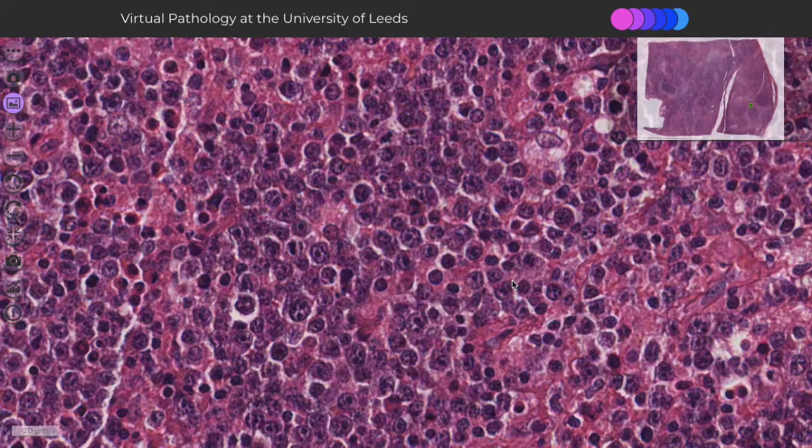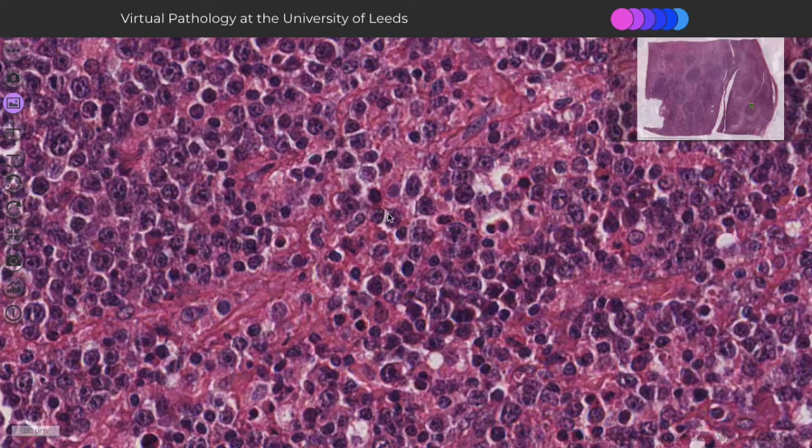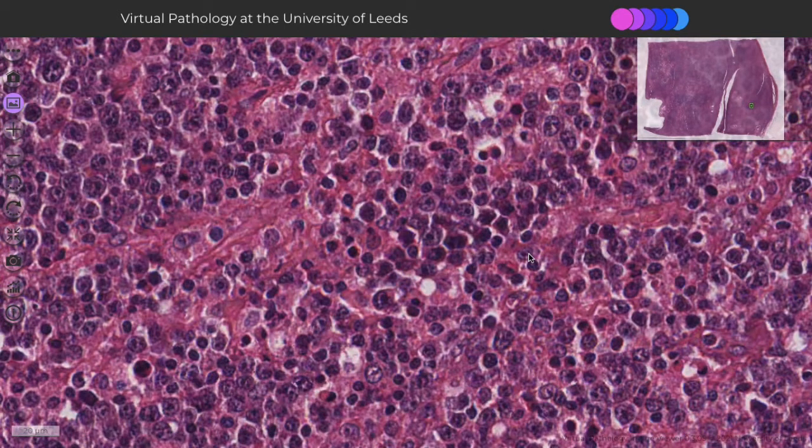Important characteristics that can help you in distinguishing a lymphoma from certain germ cell tumors include whether or not there is presence of fibrous septa with lymphocytic infiltrate, which is characteristic of seminoma. Another possible pitfall is probably considering embryonal carcinoma, especially the solid type.